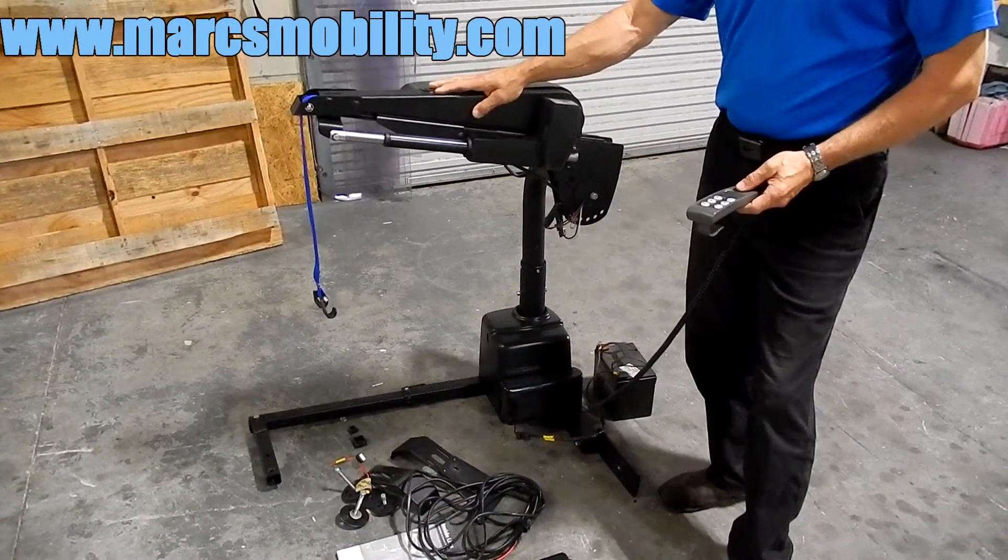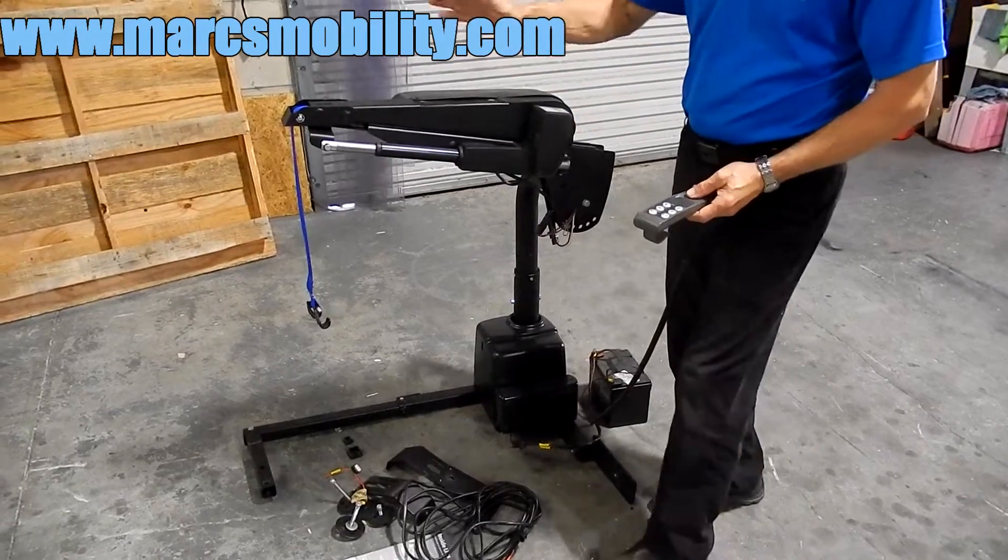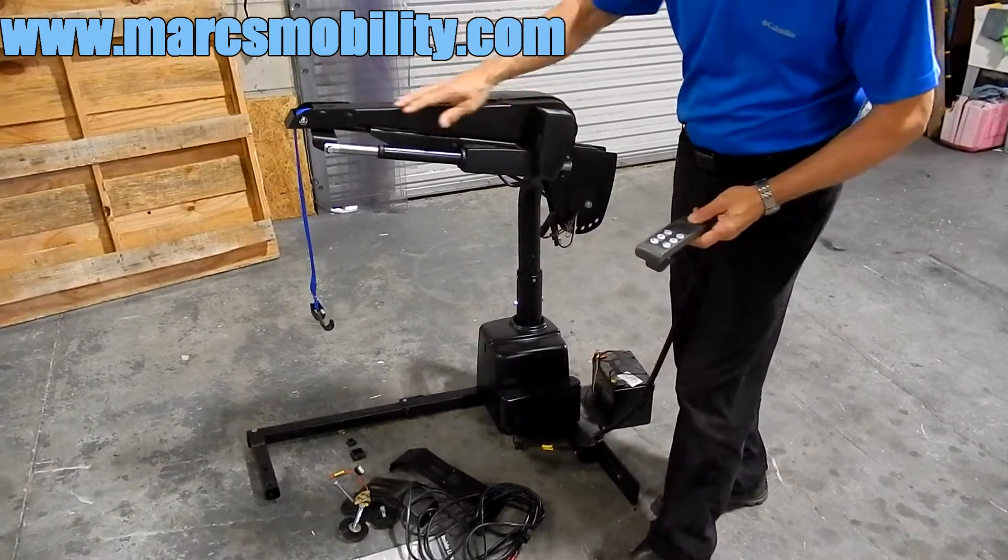It has three motors: one motor that will lift the chair up, one motor that will turn the chair back into the vehicle, and also the boom has a motor that will extend the boom.